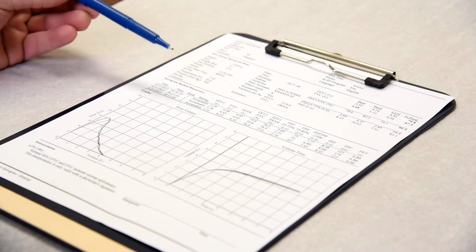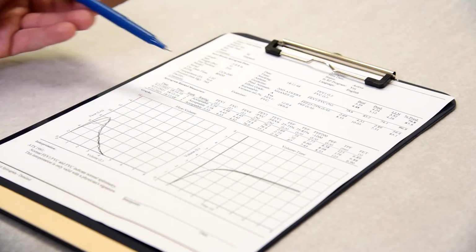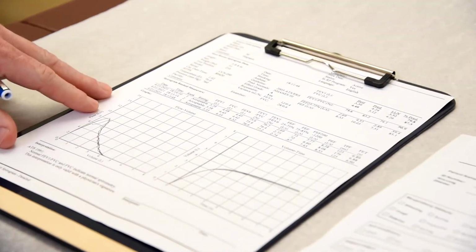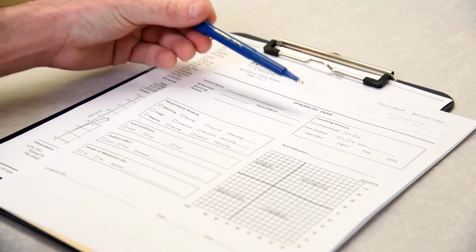So the machine does all of this work for you. So now your job is to take this information and to come up with an interpretation. So I've made this easy for you. Once you've looked at this, you will then obtain this form, which is the spirometry exam result form.